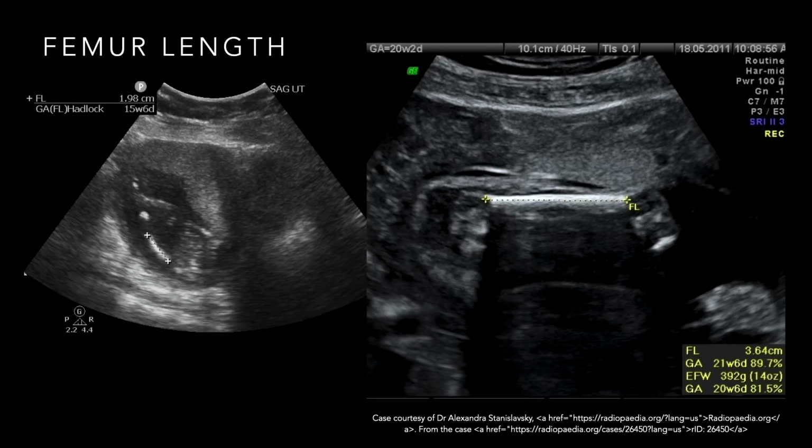And also you want to make sure you exclude the epiphysis of the femur. You can see that little ossification, the femoral head. You really want just that diaphysis of the femur, right? But if you take that measurement, again, the machine will spit out some numbers and give you a calculation of the gestational age based on that measurement.